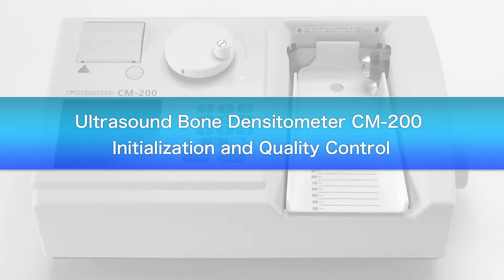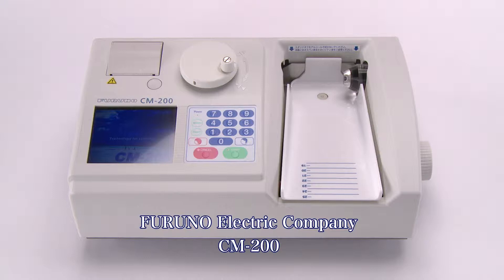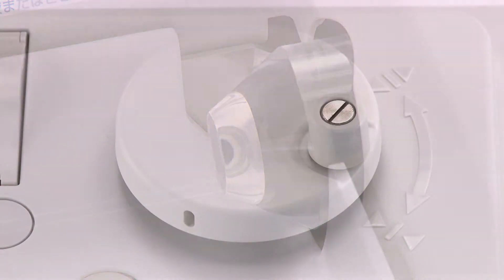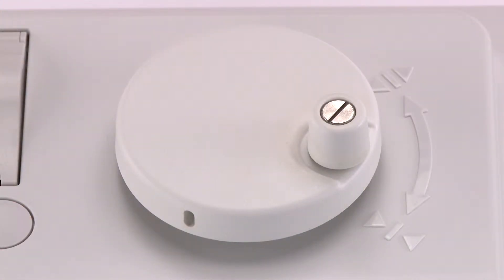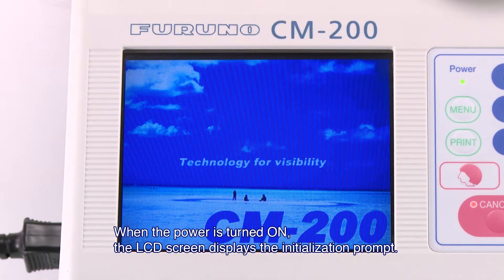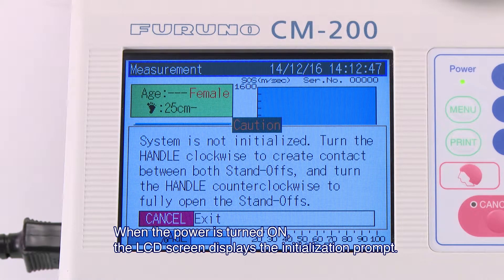We will now explain the initialization and quality control of the CM200 produced by Huruno Electric Company. When the power is turned on, the LCD screen displays the initialization prompt.